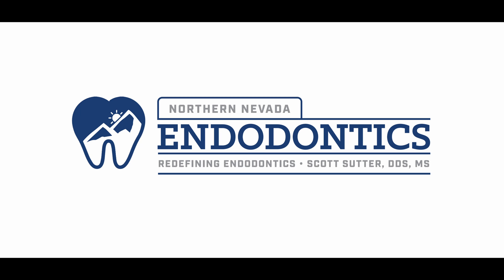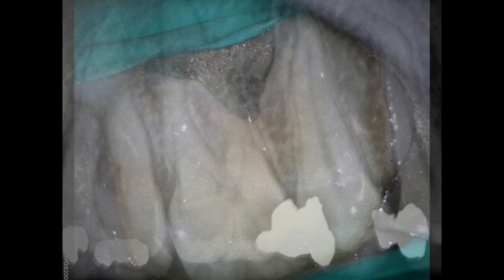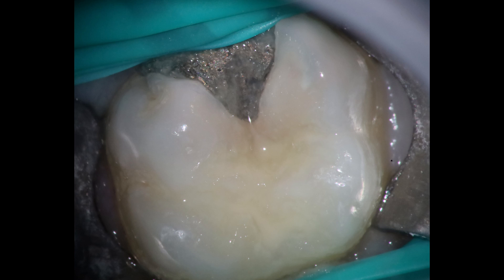Hello everyone and welcome back. Got a fun one for you today. A few people have been asking me about some tips on MB2s. So here's one with some recurrent decay underneath that amalgam. You can see clinically it doesn't look too bad — a little bit of shadowing and haloing around there — but let's talk about how we're going to take care of this one.